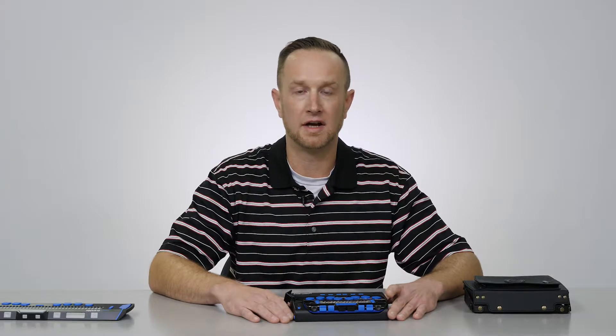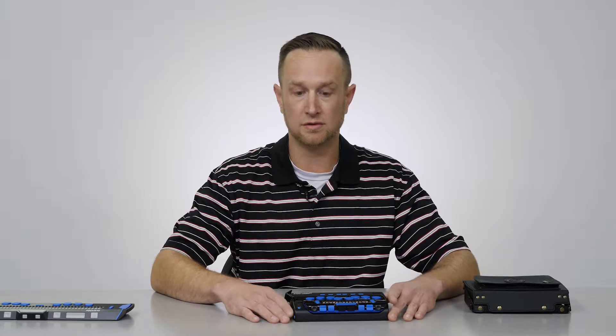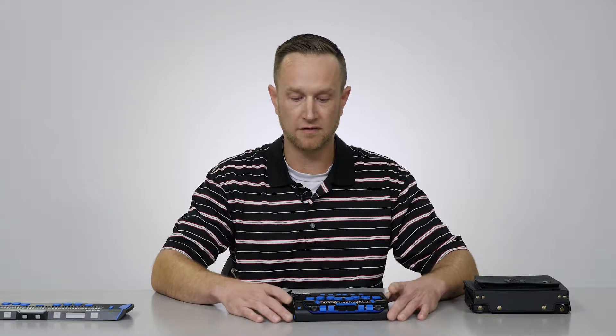and AI Squared products, now known as VFO, in the state of Indiana and Kentucky. And I'm here today to talk to you about a really cool new device from Freedom Scientific and VFO called the LBraille 14.